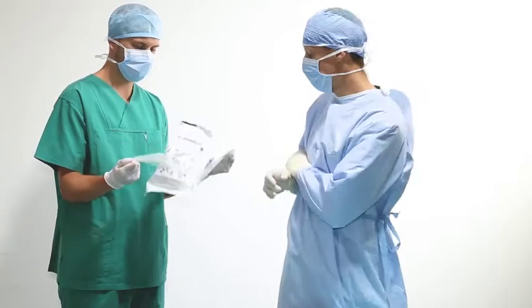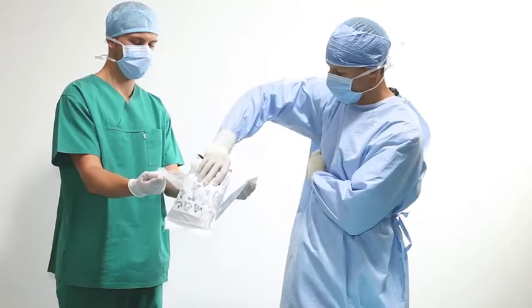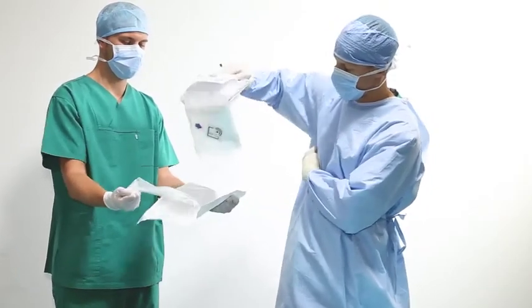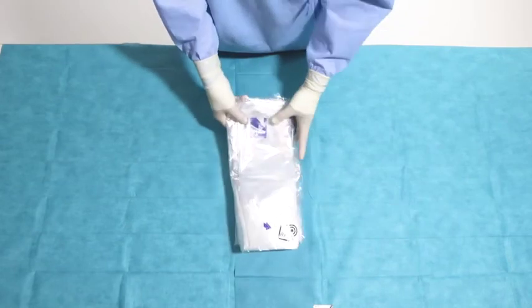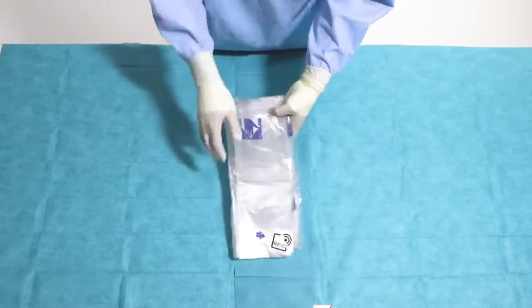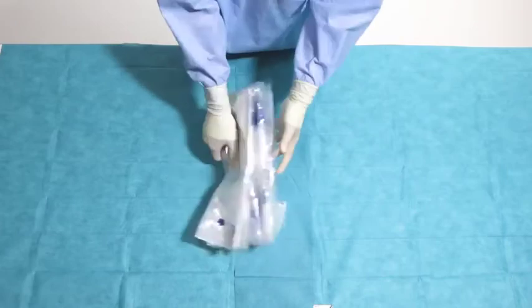The non-sterile nurse opens the pack for the sterile nurse, who lifts it up and places it on the sterile table. Unfold the Smart Drape and look for the hand symbols. The sticker is placed on the fifth layer from the top.